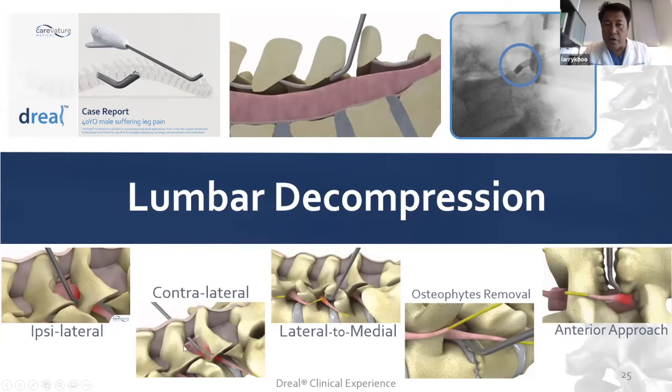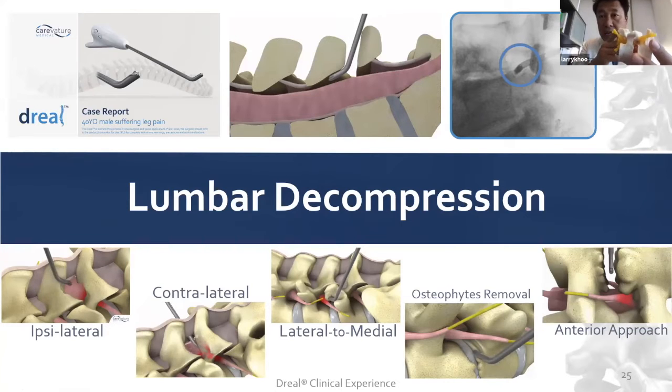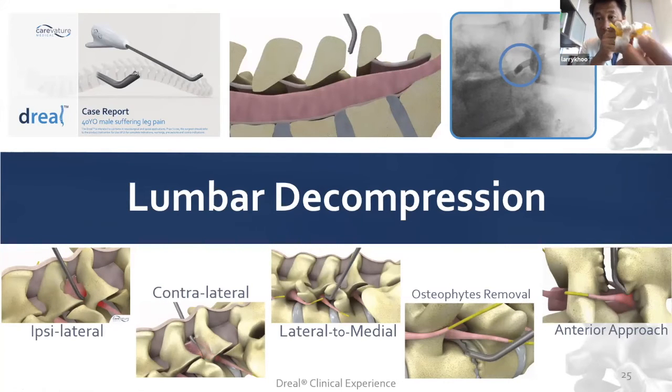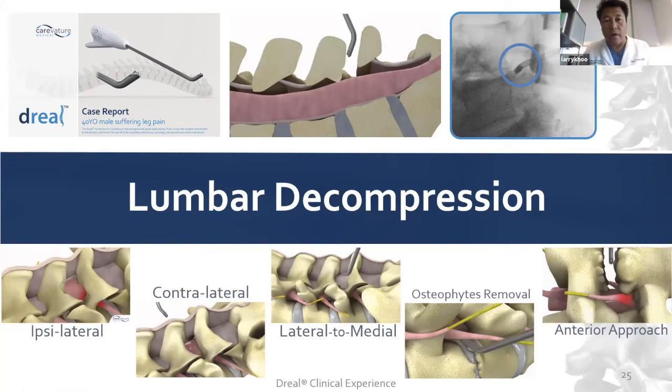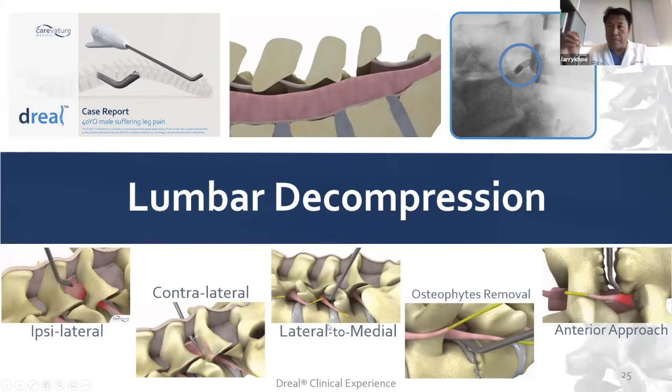Once we get enough exposure and that small midline hemilaminotomy, we can go to the contralateral side, slipping out the distal side as you can see in this camera video. We can also go from a far lateral to medial, like when you're doing a true far lateral or endoscopic-type approach.